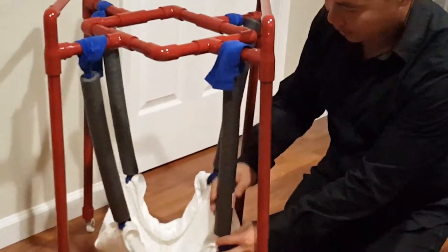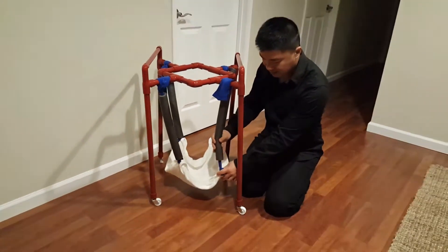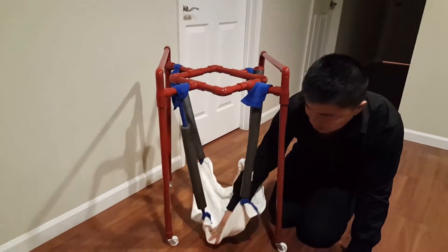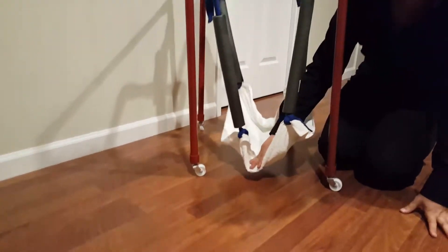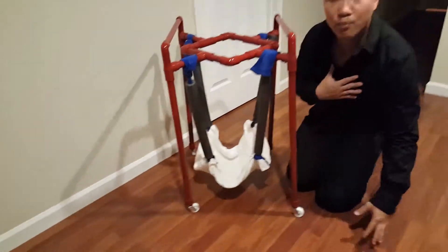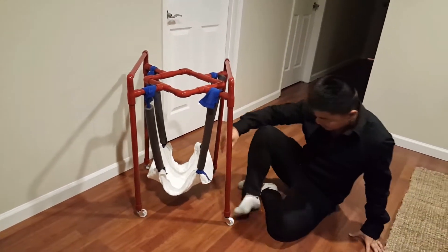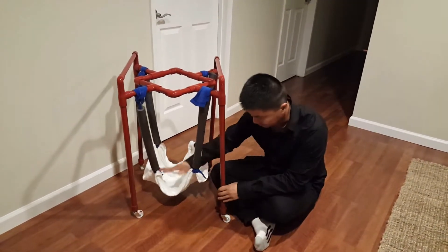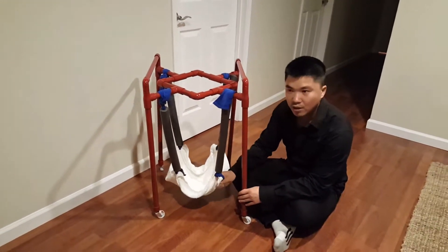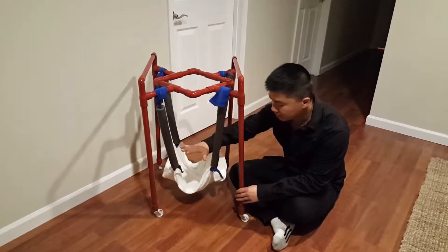Instead of using jumping cord I actually cut it from one of the pants because it's kind of elastic, so the baby can actually pull on it, and it doesn't give a lot of resistance. But if you buy it online, they come with a four-point or five-point belt — or clip, I guess — clip-on system.